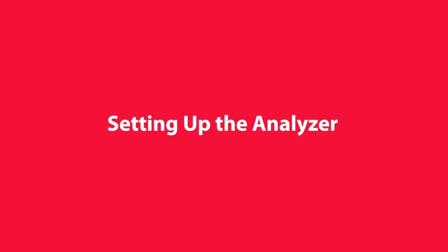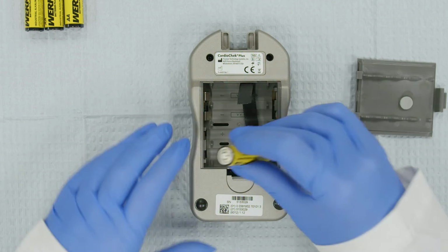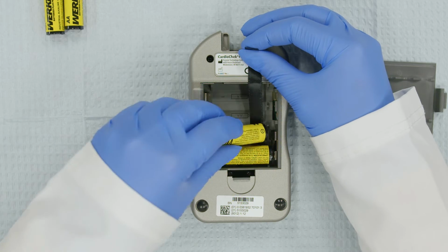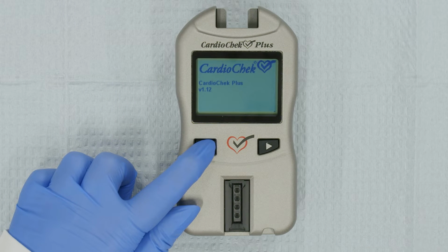The first time you use the analyzer, you'll need to install the batteries, set the language, date, and time. First, install the batteries according to the instructions in the CardioChek version 1.12 user guide. Take a moment to make sure the batteries are inserted correctly before moving on. Now that the batteries are installed, let's set the language.